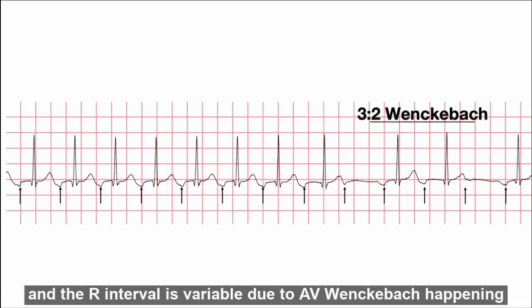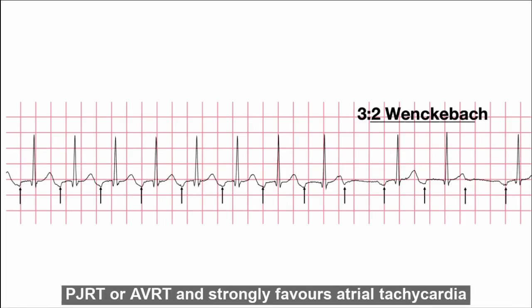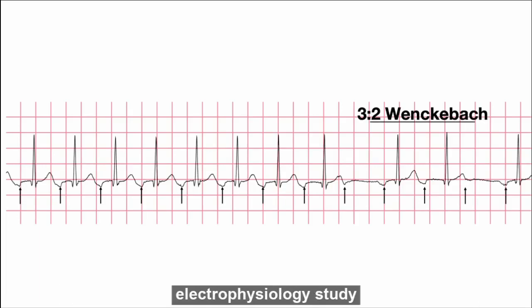This is due to AV Wenckebach happening at the AV node, and the presence of AV Wenckebach rules out PJRT or AVRT and strongly favors atrial tachycardia. This patient had focal atrial tachycardia arising from the lower crista terminalis, which was successfully ablated during electrophysiology study.